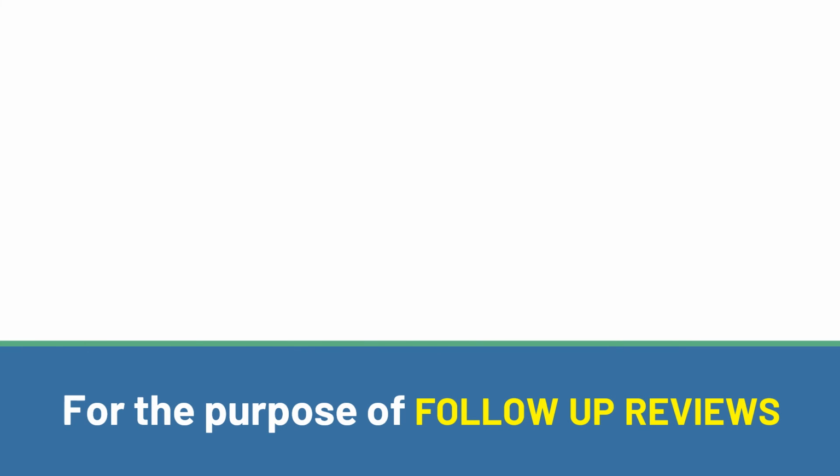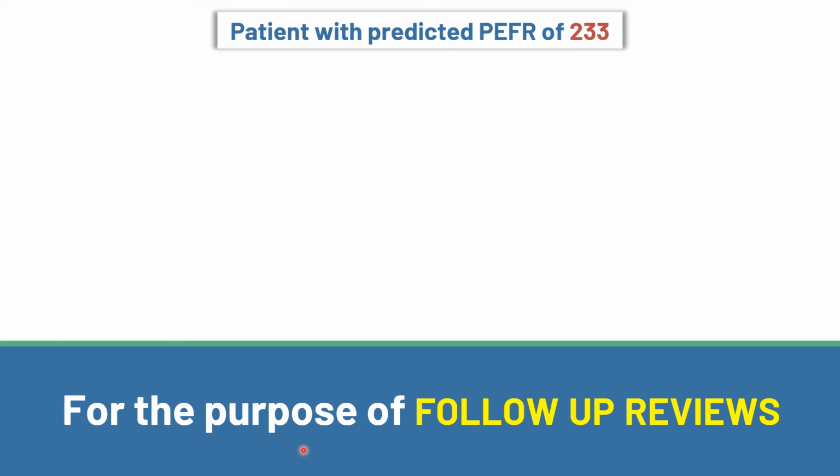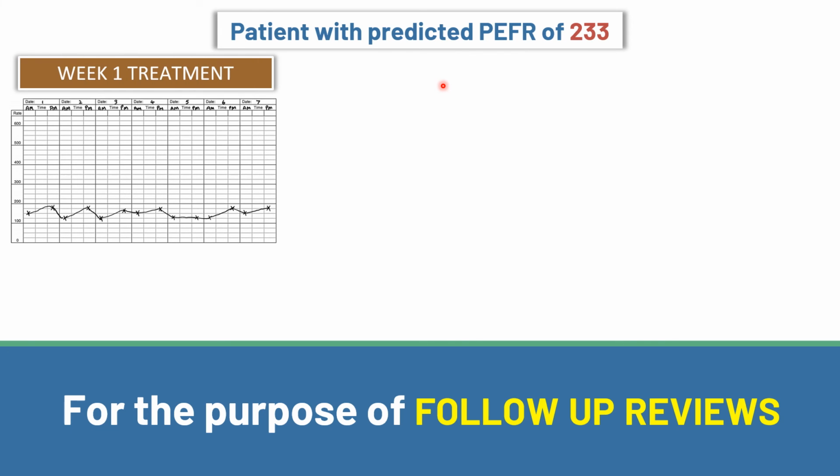Okay, so let's just tidy all of this up and let's have a look at how you might use one of those diaries in a follow-up review. So I have a pretend patient here, and the pretend patient has got a predicted peak flow of 233. That's their predicted. So week 1, they get started on treatment, and after the end of week 1, they come along and say, "Right, here we go. I started my treatment here. This is my week of peak flow recordings for you to interpret."